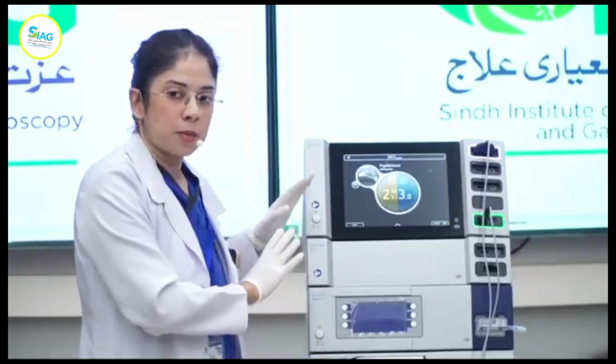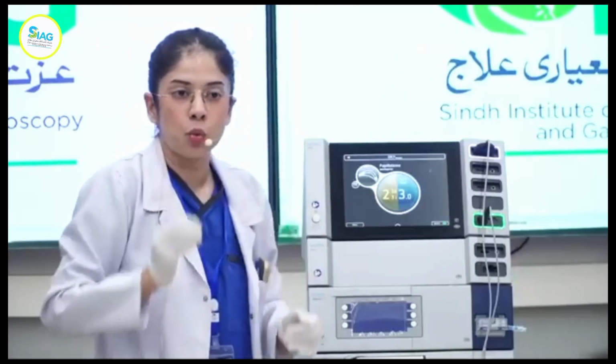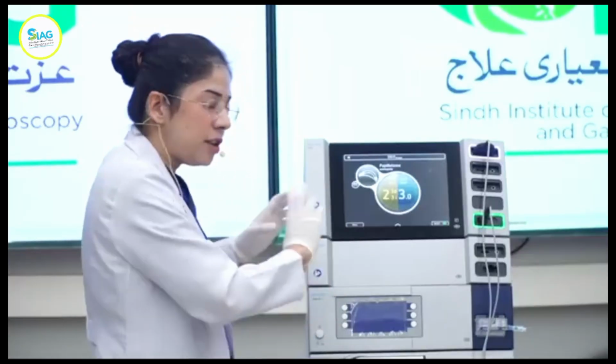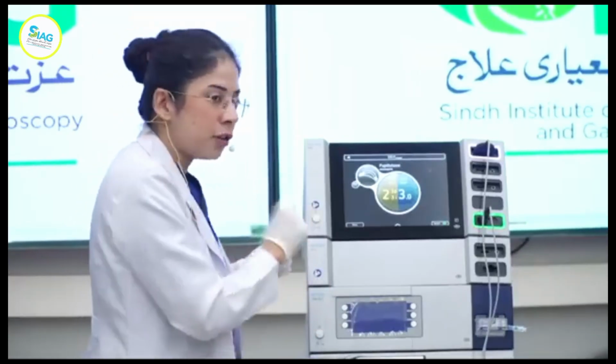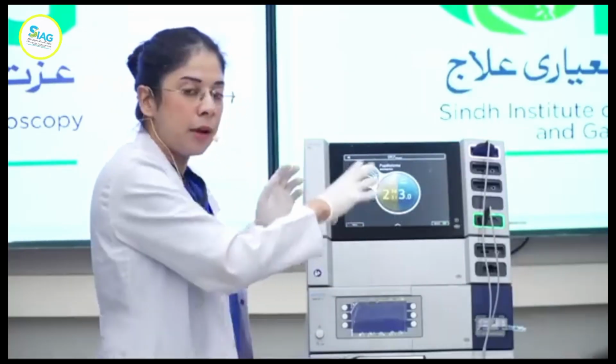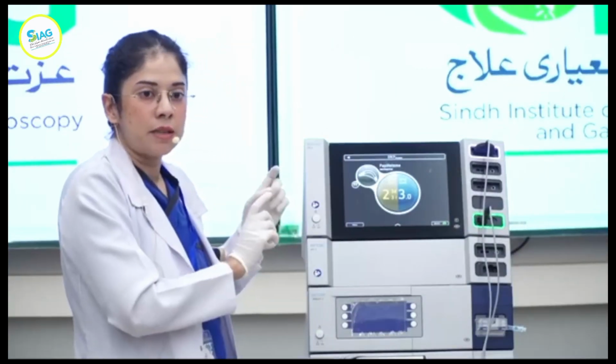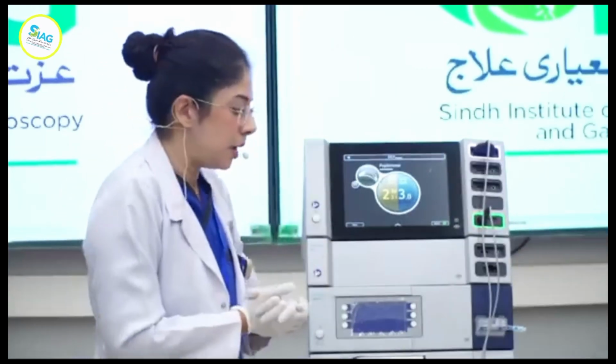These machines are very smart. They can actually calculate the resistance change in the tissue while you're cutting it, and then they change the voltage accordingly. You don't have to keep asking your tech or keep pausing and fiddling with the machine. It can calculate the resistance as you're burning the tissue, and it does the minor adjustments. Of course, the major ones need to be done by you.